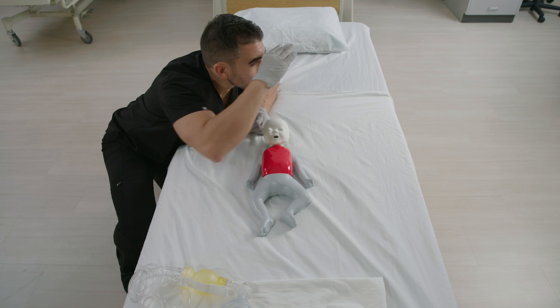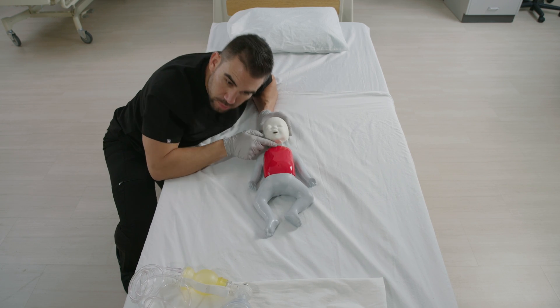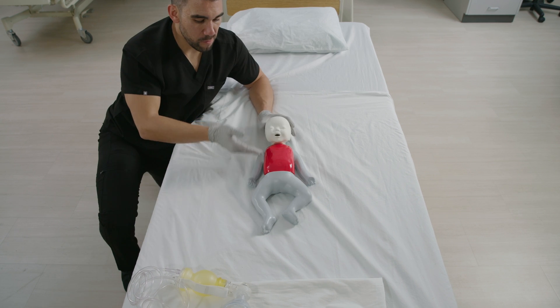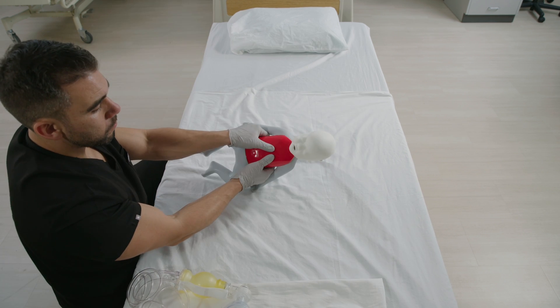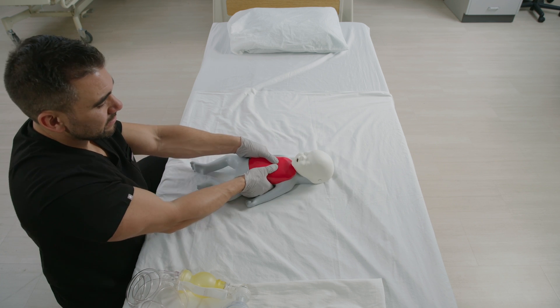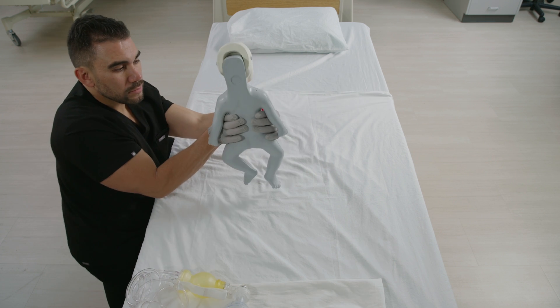Steps for CPR on an infant. Check the scene for safety and obtain consent from the guardian. Check for responsiveness and breathing. Call 911 or tell someone else to do so. Place the infant on their back on a firm, flat surface and stand or kneel beside them with your hips at a slight angle. Give 30 chest compressions by placing both thumbs side-by-side in the center of the baby's chest, just below the nipple line. Use other fingers to encircle around the baby's chest for support.